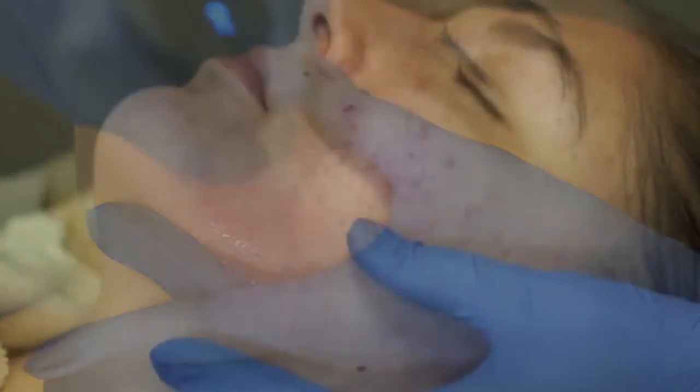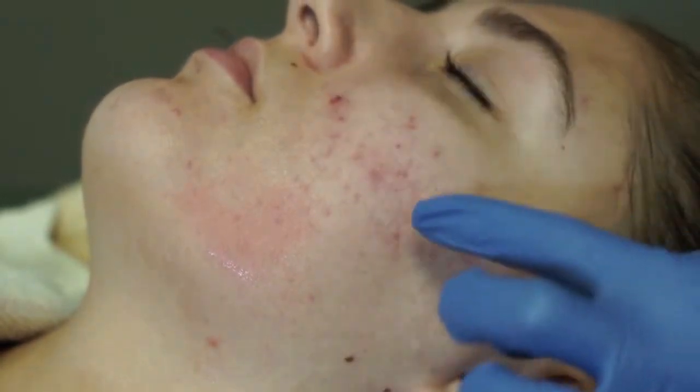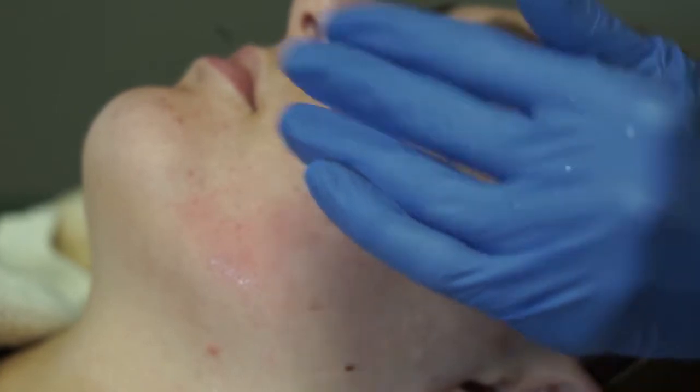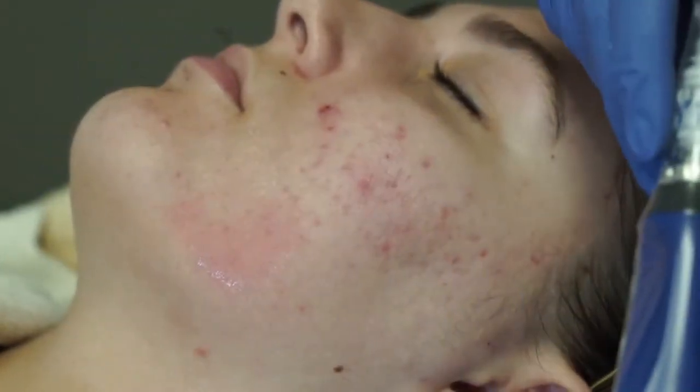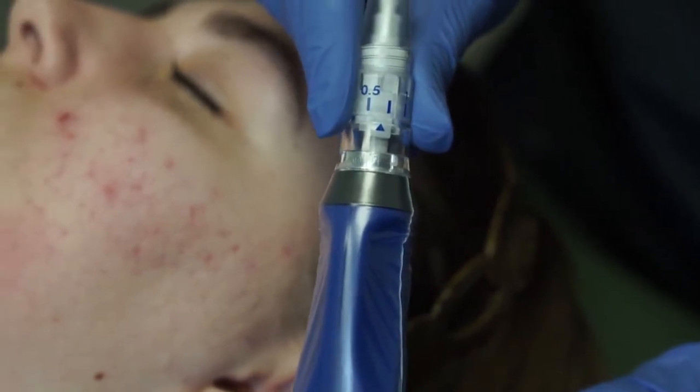It is recommended to treat the face in a series of 4 quadrants, starting with the right cheek and moving to the chin, perioral area, and nose, then to the left cheek, then to the forehead. For treatment of acne tissue, a depth of 1.5 mm may be used on the face.